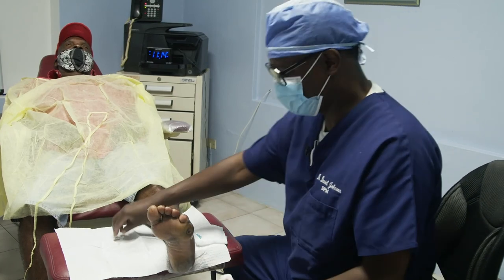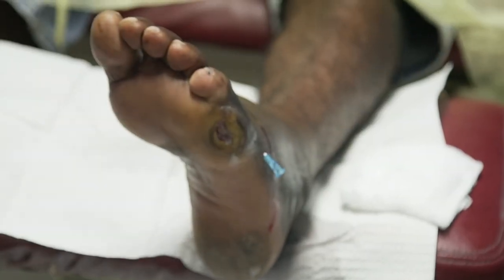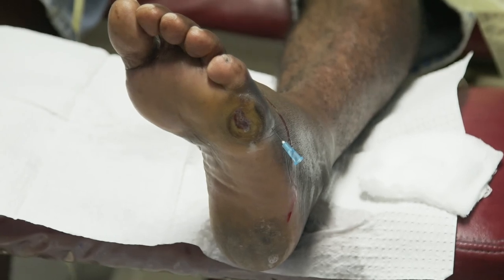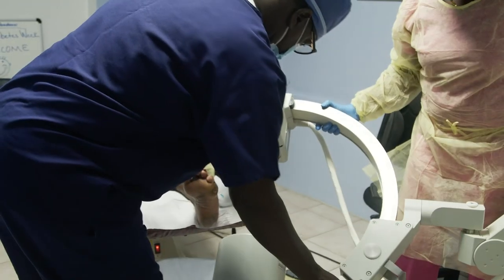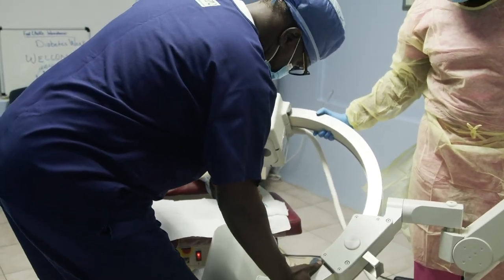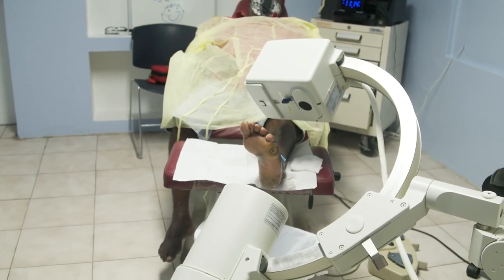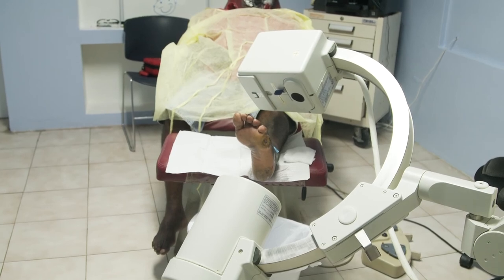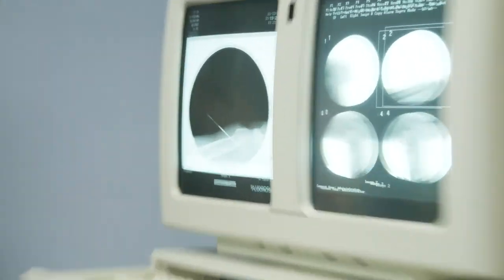So now we're going to take a picture, so we'll see where that instrument is relative to the joint I want to go in. Do an x-ray for me. Good. Okay. So that spot is where I'm intending to go. I'm going to slide this right in here now. Come right to him. About there. Let's see. I think that might do it. Shooting. Good. So you want to take a picture of that? And now we see where we are.